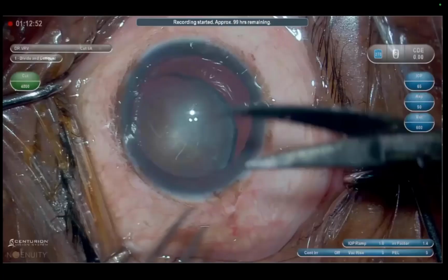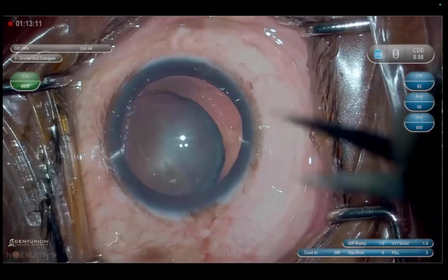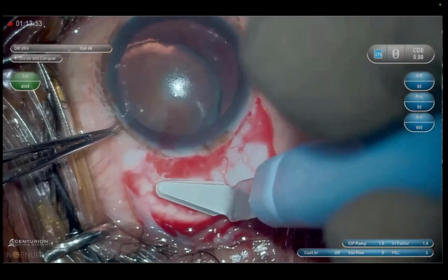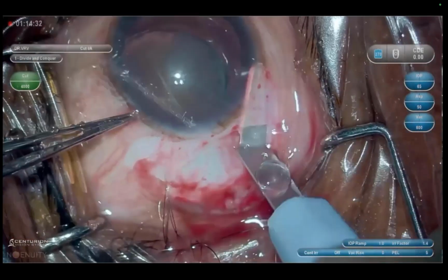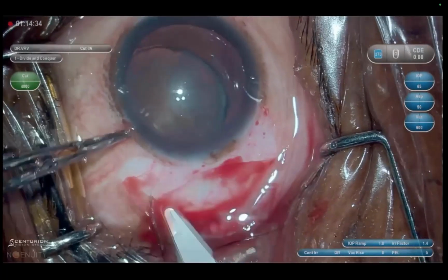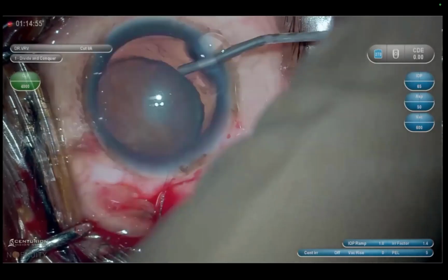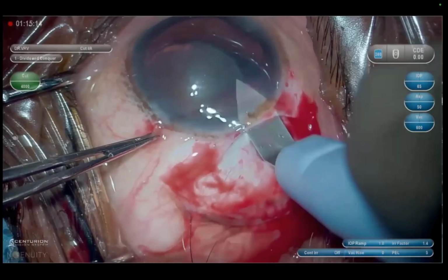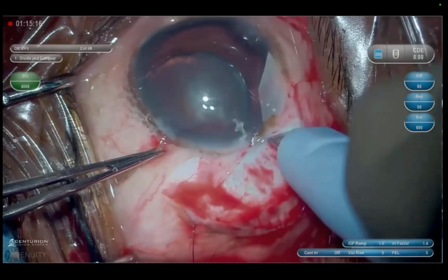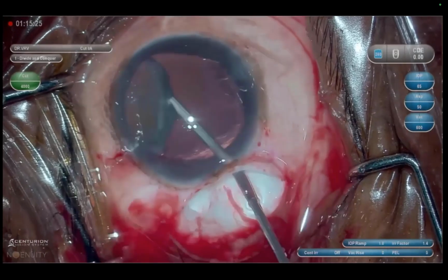So moving on to the surgical technique. This is a traumatic cataract where you can see the lens is subluxated. In these cases, since you're going to remove the nucleus in toto, you have to make a little larger incision. A proper sclerocorneal tunnel is made, because if the tunnel is bad, I will not go ahead and do this procedure. It's very important to have a watertight sclerocorneal tunnel.